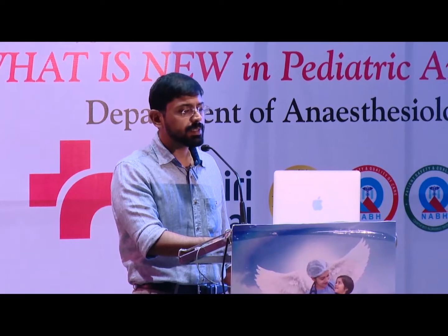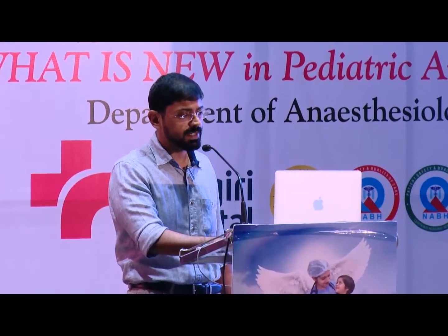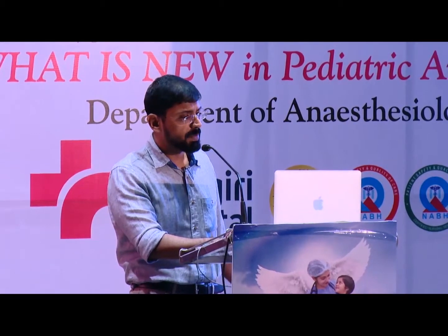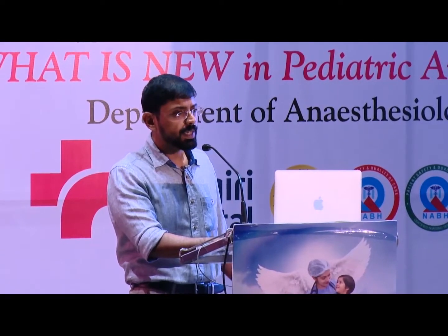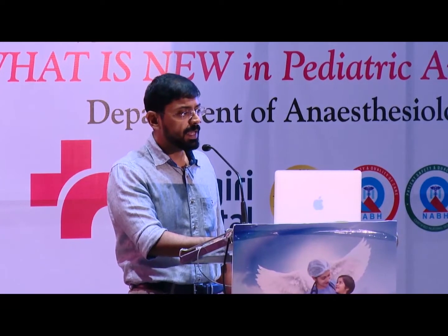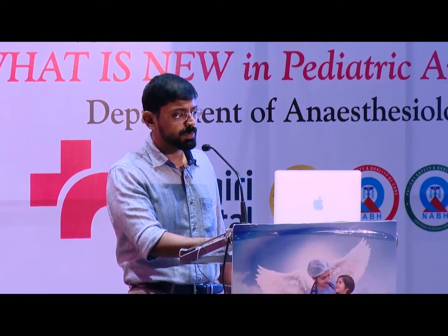So at this point, what we do is, we take an X-ray just to make sure that there are no other factors which worsen the ventilation. And our fears turn out to be true because this baby has got a collapse in the right upper lung and his ET tube is also a bit low. So we make the necessary adjustments, we give him physio, the ET tube is pulled back, and the next gas actually shows that there is an improvement.